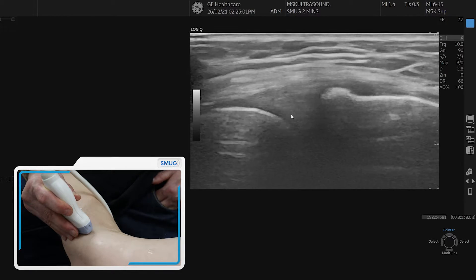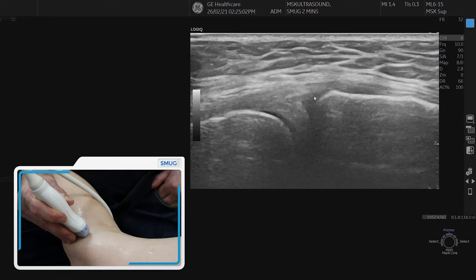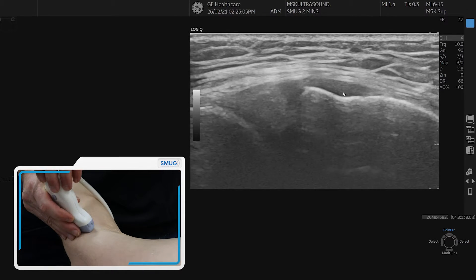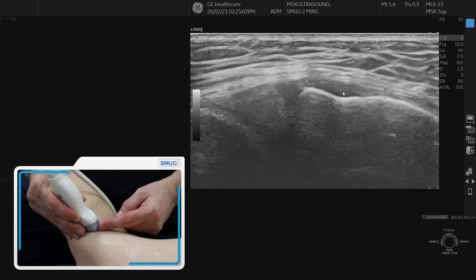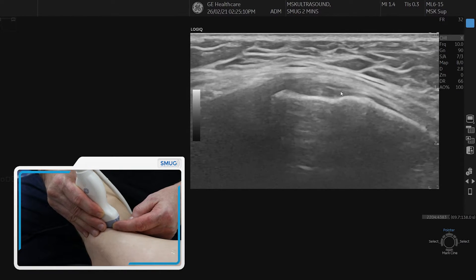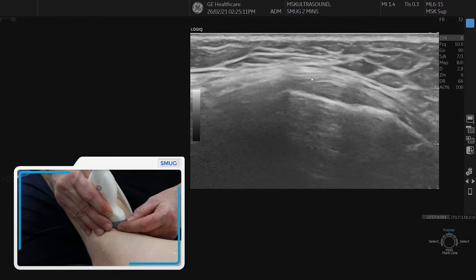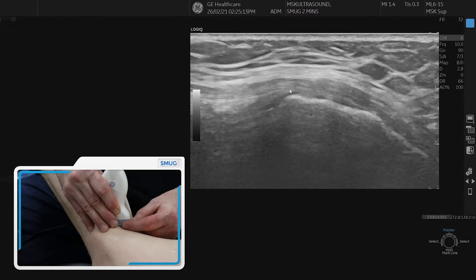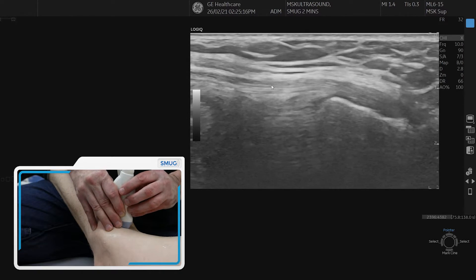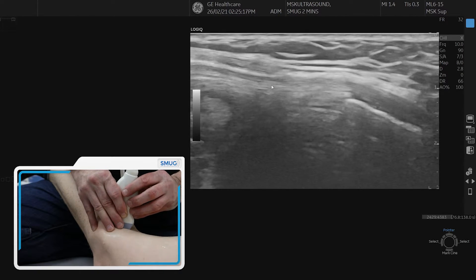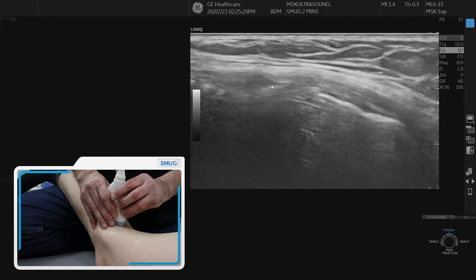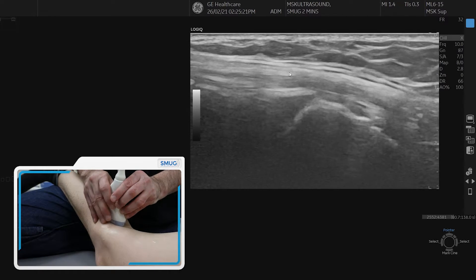To line up the fibers of the semimembranosus, we're going to turn the proximal part of the probe medially — fish-tailed — until we see the longitudinal fibers of the semimembranosus coming through. That's your first assessment point: the semimembranosus tendon.